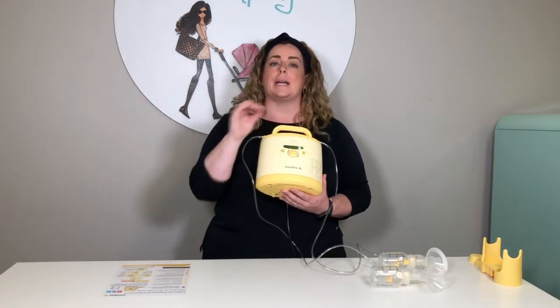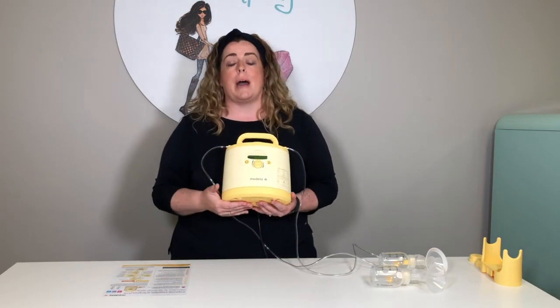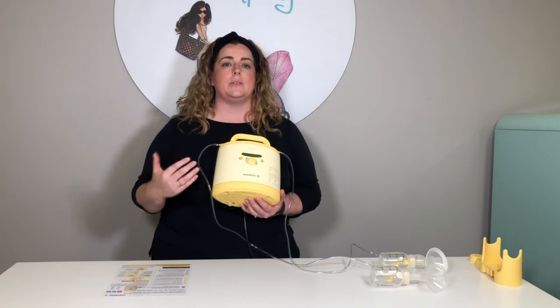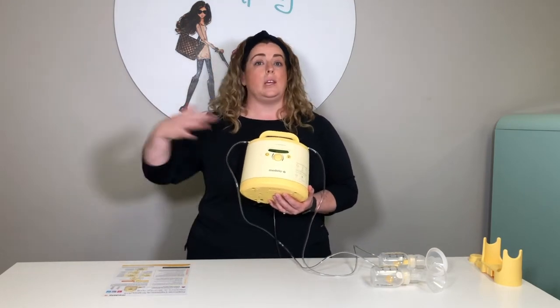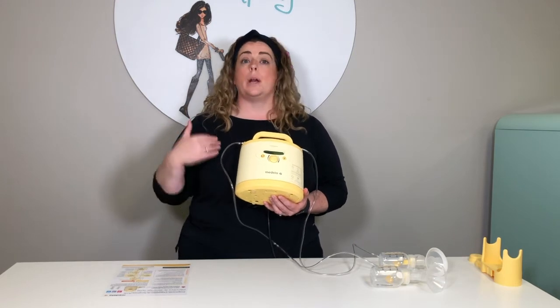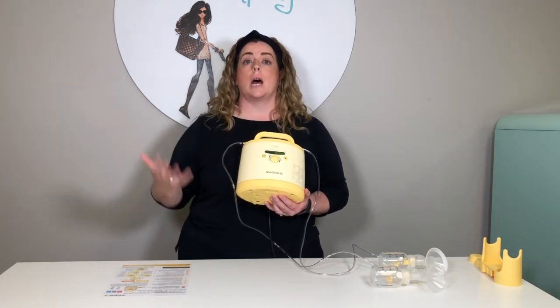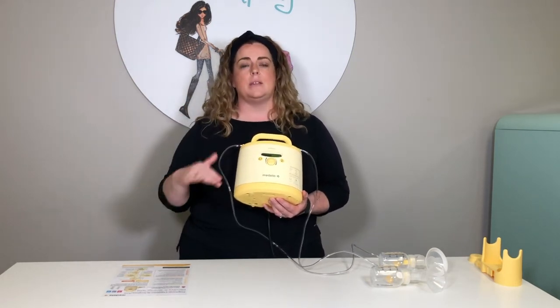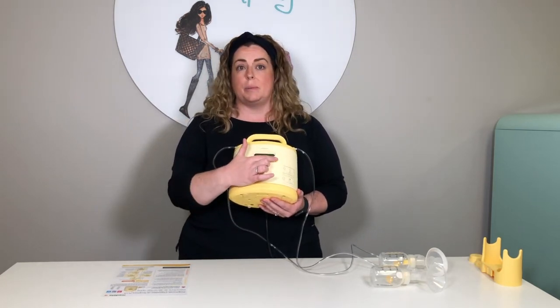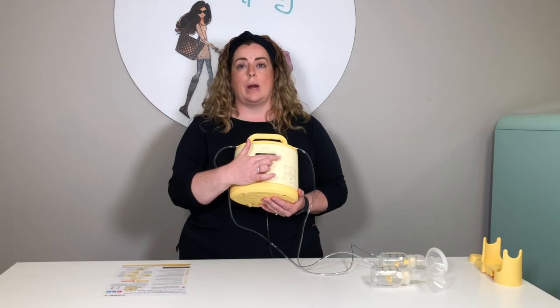So to go back to what I talked about, one of its magic powers is how it initiates your supply. So if you have your babies prematurely, they're in the NICU and you're separated from them, or your baby is born and for whatever reason you're choosing not to breastfeed or you can't breastfeed, but you still want to be able to give your baby your milk, then this is the button that's going to work tremendously well for you.